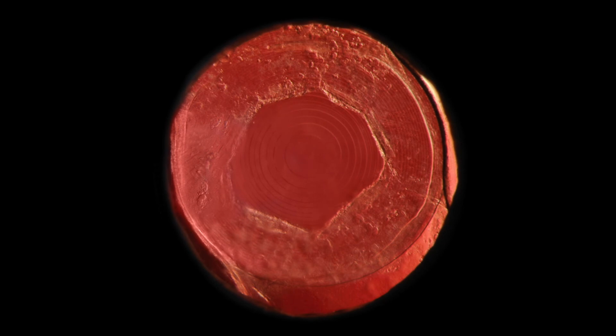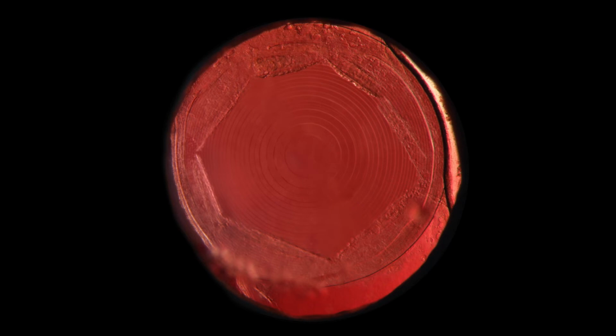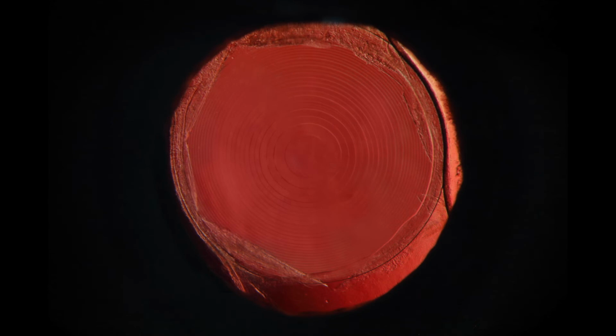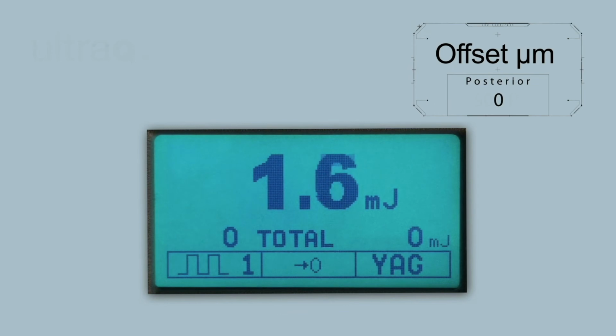The following images were not created in Photoshop but with the cooperation of this patient who without complaining moved back and forth several times between the YAG laser and the slit lamp camera, enabling us to capture a photographic record of this real-life situation. I will now show you another photo animation of the procedure followed by real-life surgery.